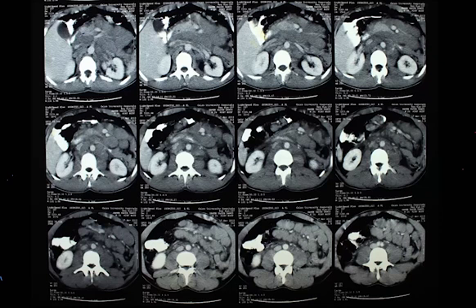So we rely on giving people oral contrast, which they swallow and ingest. It takes time until it gets inside their bowel loops, and it's never homogeneous. If you want to fill the rectum, you go for rectal contrast. The contrast is not barium, because barium is usually too dense for CT. Because of CT's extreme sensitivity, you don't usually use barium. You use Gastrografin. Okay.